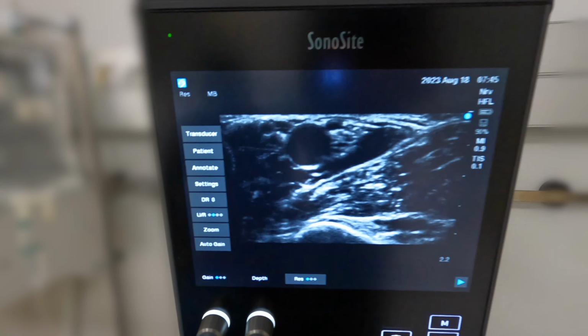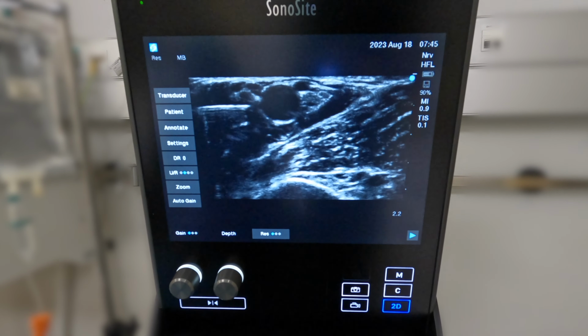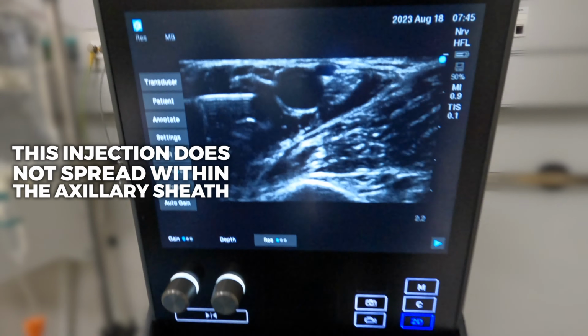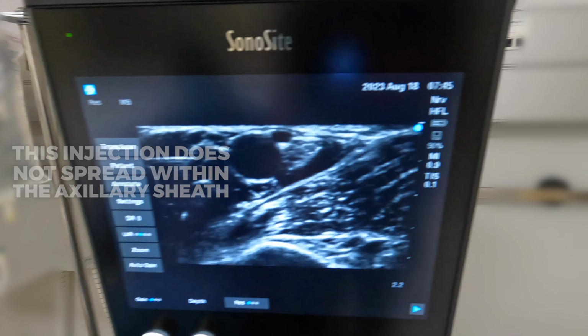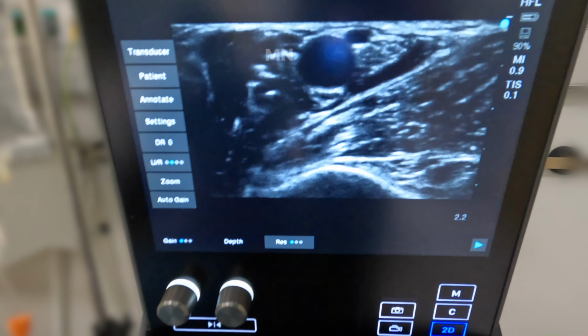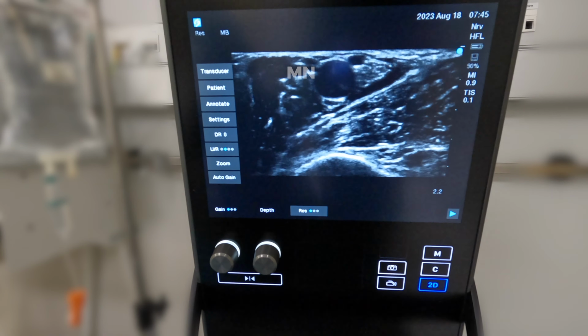What we're going to do right there. Pull back. Inject 1 cc again. This is for the median nerve. Okay, we're not getting the spread we want there. So we're going to go back with the needle and on top of the artery here. And so we're going over the median nerve. Keep going. Yes. Keep going.